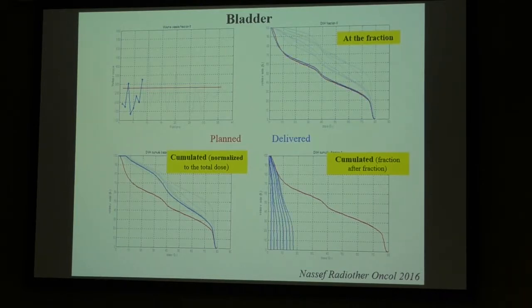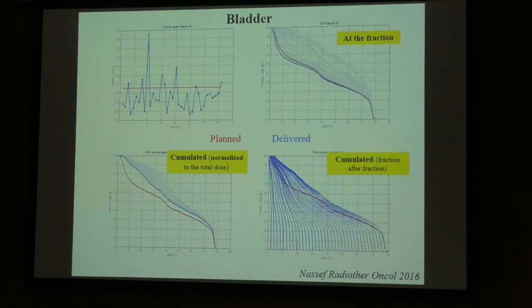It's a kind of dose monitoring. And then being able to really realize that the accumulated dose may be really different from the planned dose.